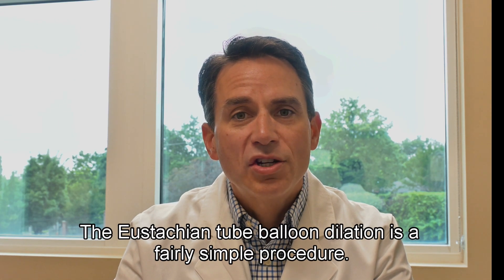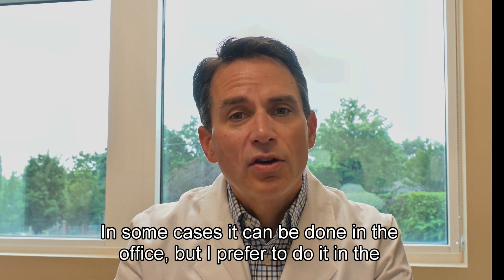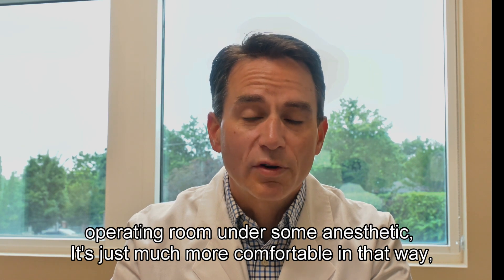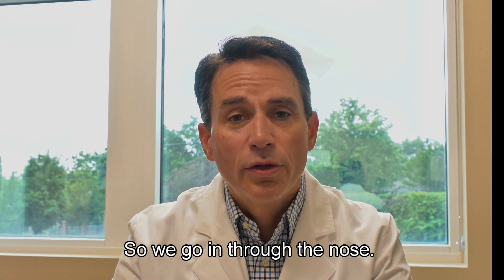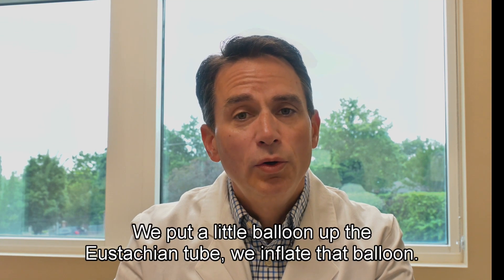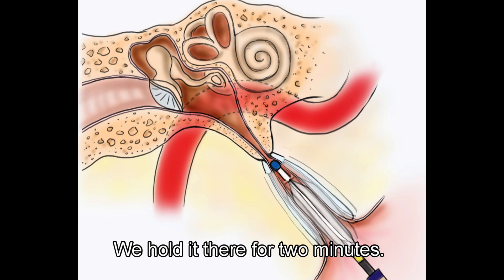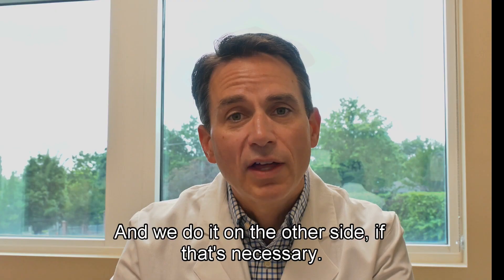The eustachian tube balloon dilation is a fairly simple procedure. In some cases it can be done in the office, but I prefer to do it in the operating room under some anesthetic — just much more comfortable that way. It's all done through the nose: we go in through the nose, put a little balloon up the eustachian tube, inflate that balloon, hold it there for two minutes, deflate the balloon, remove it, and do it on the other side if necessary.